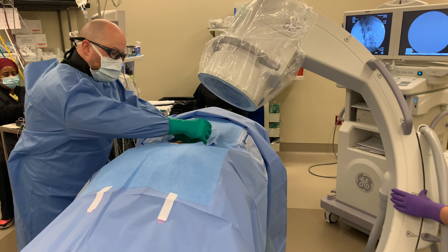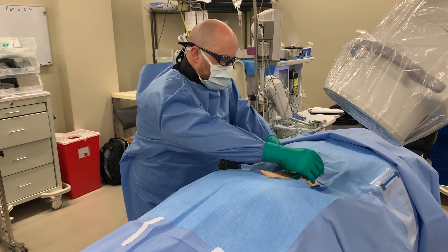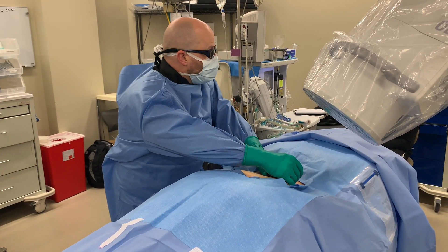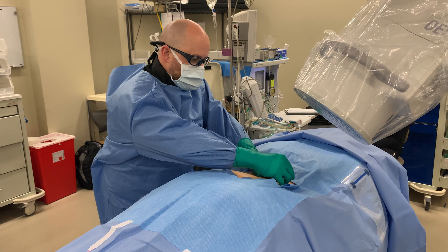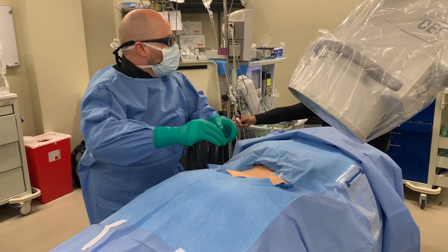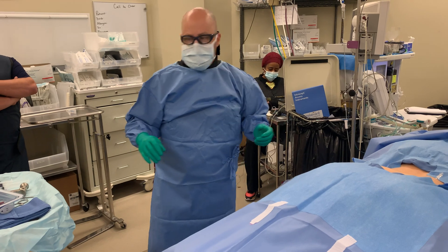First, we start off by marking our anatomical structures and placing the spinal needle down to the insertion point so that we can numb up the outside of the bone and the skin, muscle, and subcutaneous structures to help with both the intraoperative stimulation and to help with the patient's comfort.